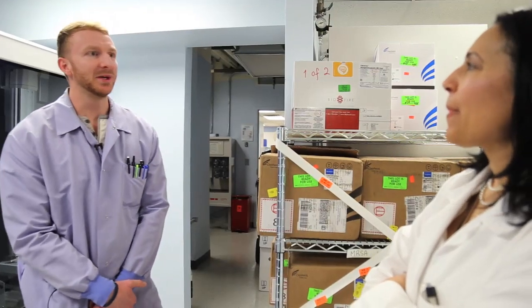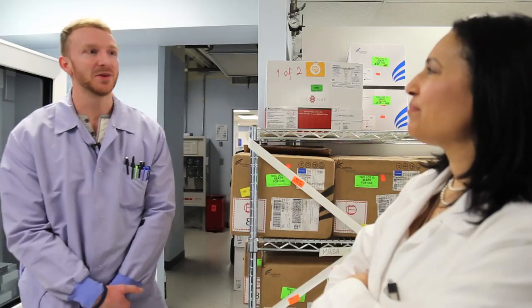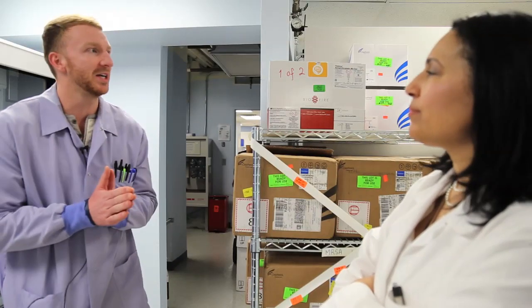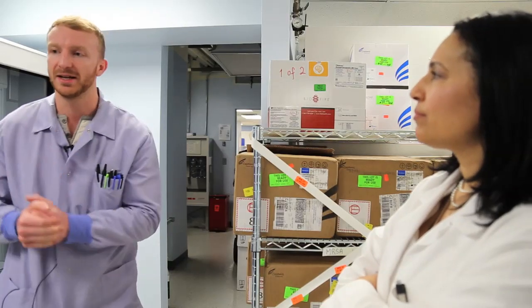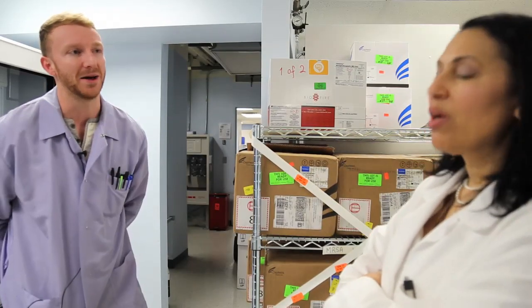But yeah, we're really diversified in our different instruments here. Some are very low tech. Some of our antigen testing is colorimetric, where you're just looking to see if there's a colorimetric reaction. Some of it is reading plates and determining colony counts, and others is setting up a PCR reaction. So it's a very diversified set of tests that we have here in the microbiology lab.